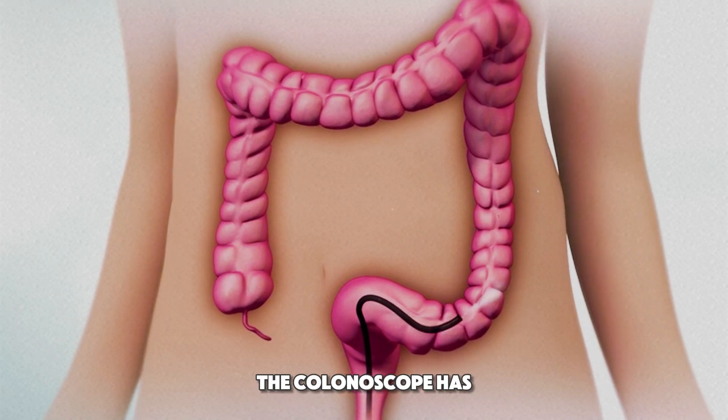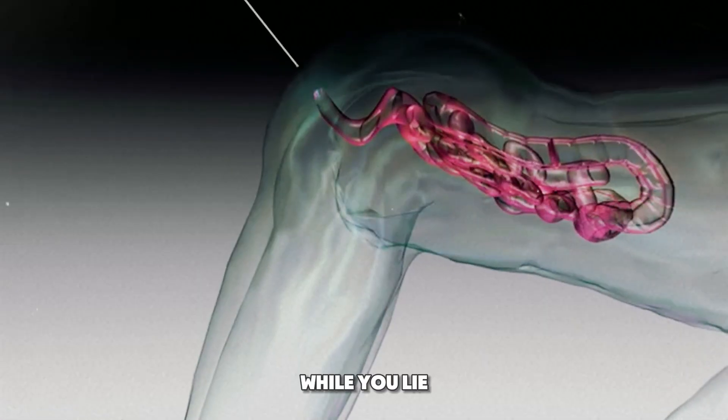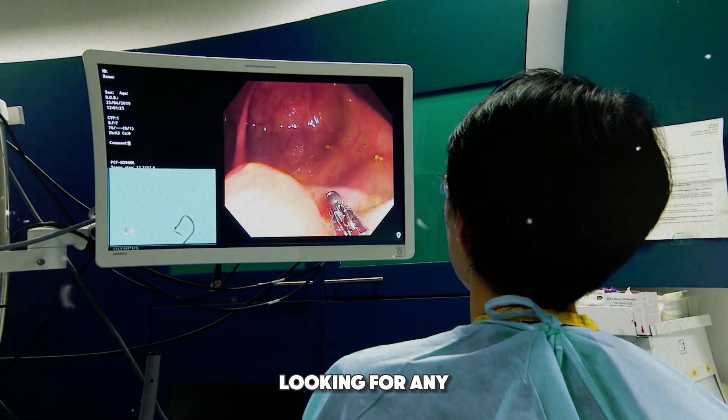The colonoscope has a light and camera on the end, allowing the doctor to see the inside of your colon on a screen. While you lie on your side, the doctor slowly guides the colonoscope through your colon, looking for any abnormalities.